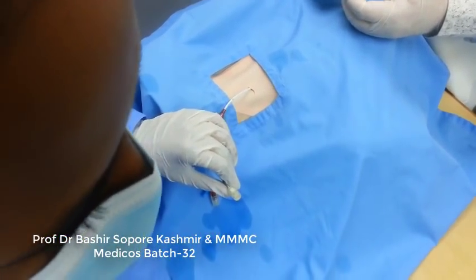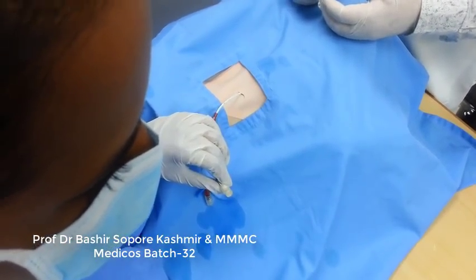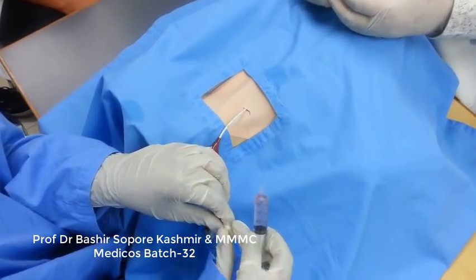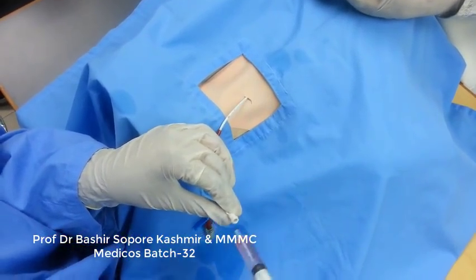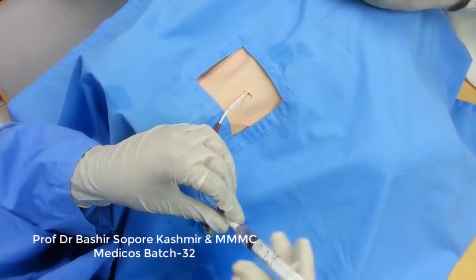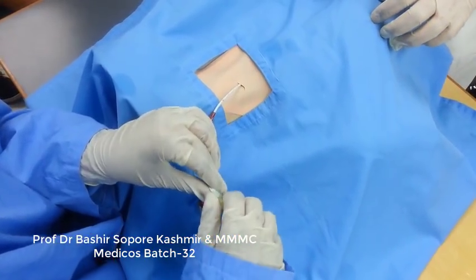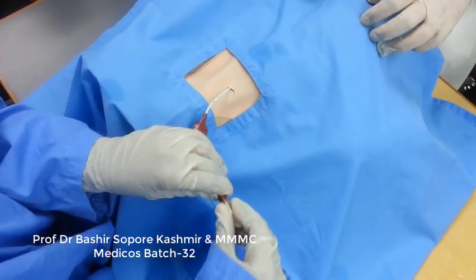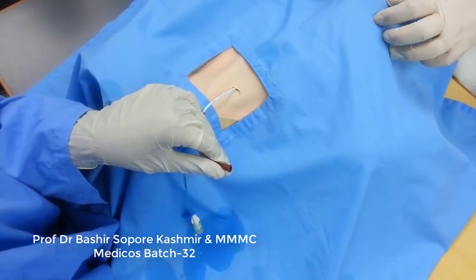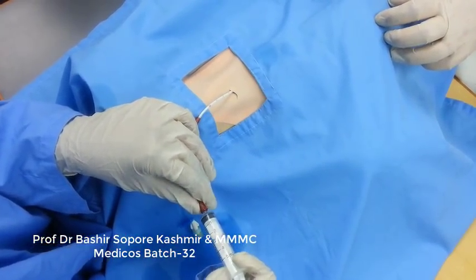So you take around 20 ml heparinized normal saline, isn't it? Heparinized normal saline you take, then for each port, and then flush it. Okay, done. Then put the knob, right? Take the other one. Be careful. Okay, so done again here. Yes, then put the knob.